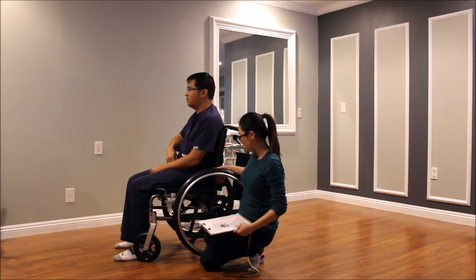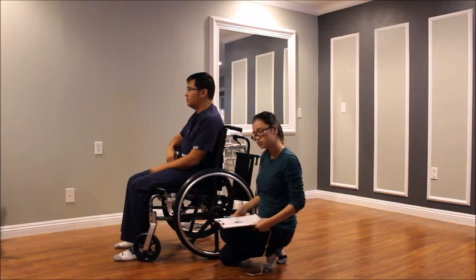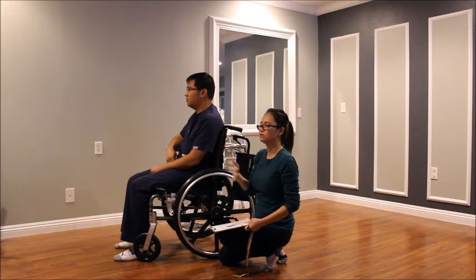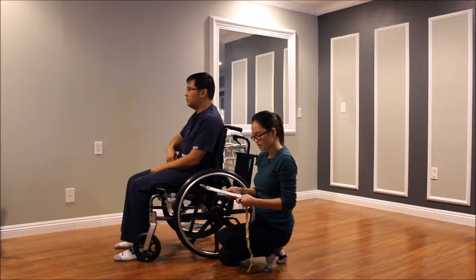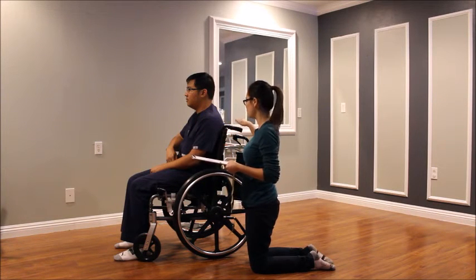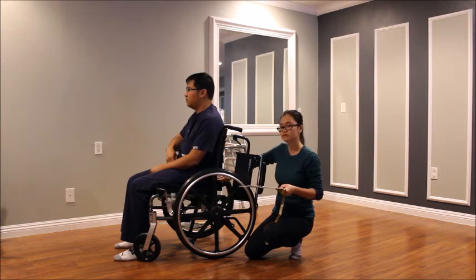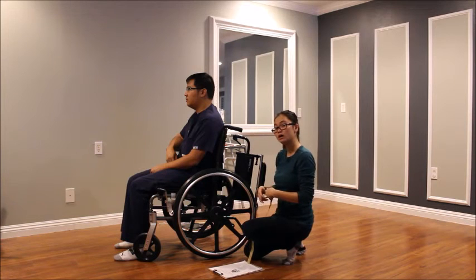Okay. And the next one, we look at the back height. Patients should have a back height right here. And usually we look at 3 different categories. We have to determine if a patient needs extra cushion for the head, for example, a patient who has cerebral palsy or spinal head injury. And the other one is if a patient is self-propelling or not. So that's a different one. And the other one we measure from top of the shoulder to the buttock area for a general basic wheelchair. For him, he is a self-propelling patient.